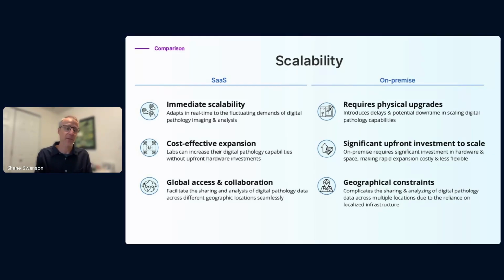And geographic scalability, if you're multi-regional, of course you can scale in that direction as well. Whereas an on-premise, your scale is again limited by what you could afford to install and maintain. And as far as geographic constraints go, again, you might have to network between your locations and access a common data center, or you have to replicate your systems to each of those locations if you have multi-site geographic scalability.